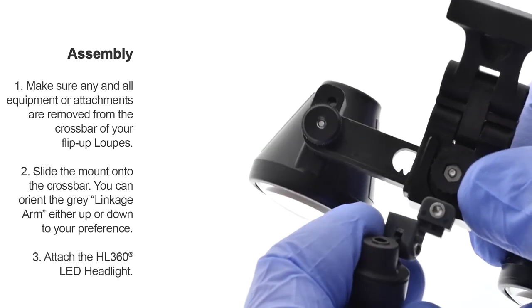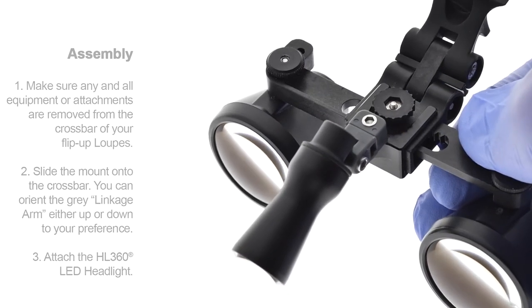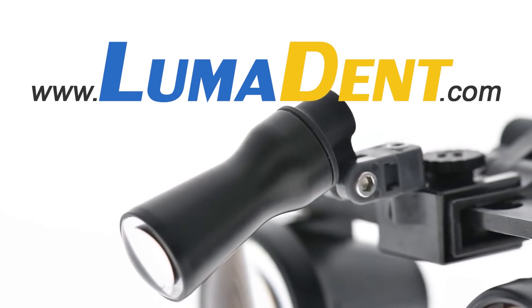Attach the HL360 LED headlight. Thank you for choosing Lumadent.